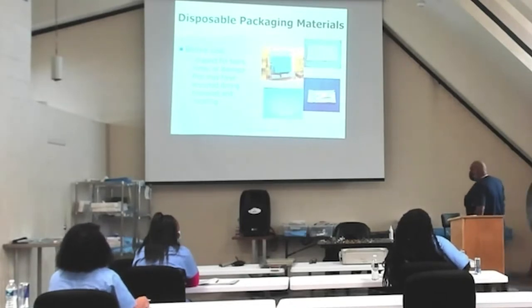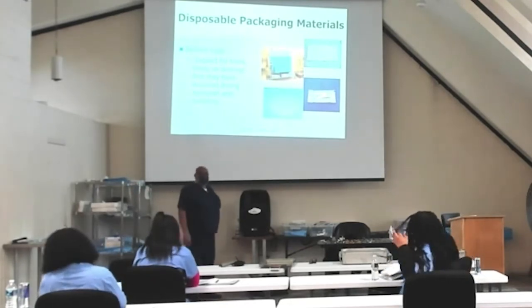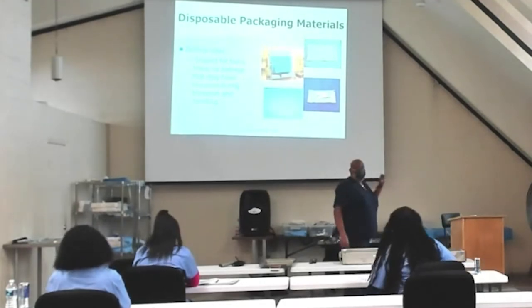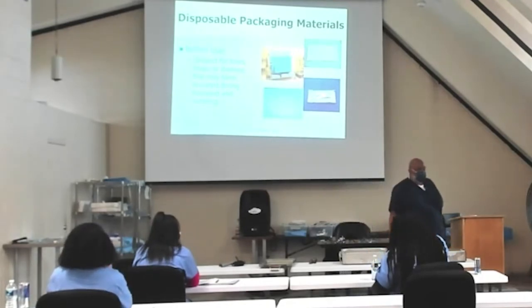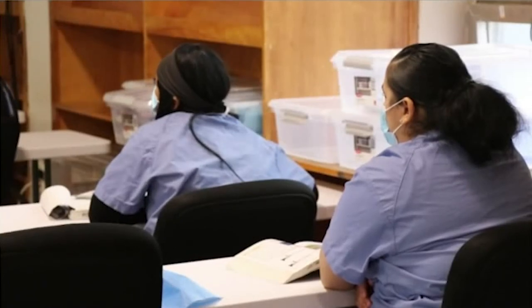And I know somebody's going to tell me what they are. The orange ones that we've been using that I don't see now that I want one. The locks, that's one word for them. What else can we call them? Tamper evidence seals. Good one, Terrell. And tamper evidence seals. They could be arrows, like we've seen. They could be locks. They could be orange. They could be blue. But they have to serve the same purpose, meaning they will let us know if the tray has been tampered with, therefore, it's disqualified. The filters will be round or square, depending on the container. And some hospitals have filters for different methods of sterilization. Some are universal, and some they only use on the low temperature, okay?